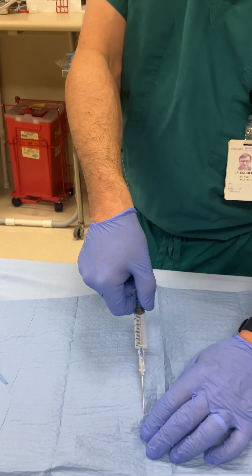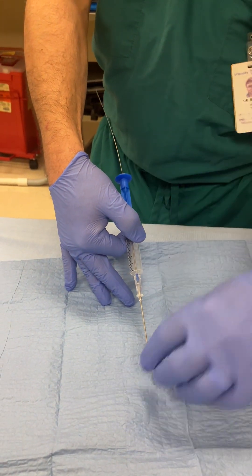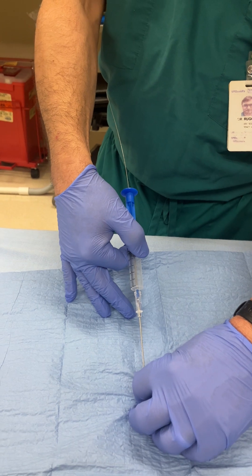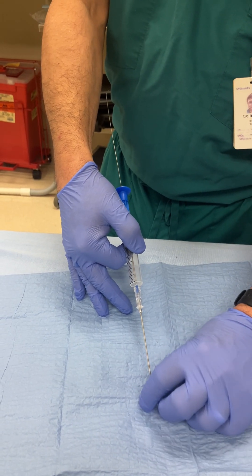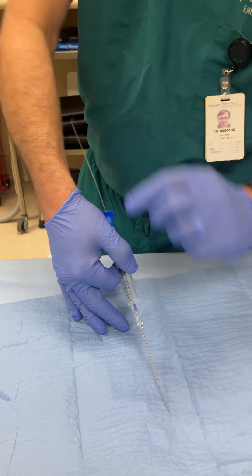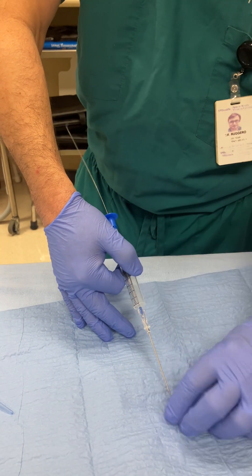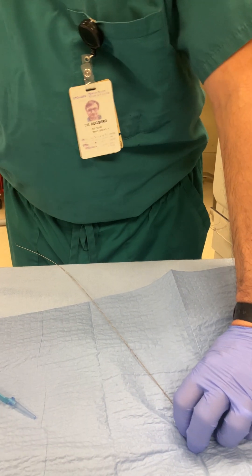I'm going to remove the syringe. I'm always keeping control of the wire — it's not going to get sucked into the patient, but what students or residents might do by accident is push the wire in if they don't always maintain control of a portion of the wire. I've removed my needle.